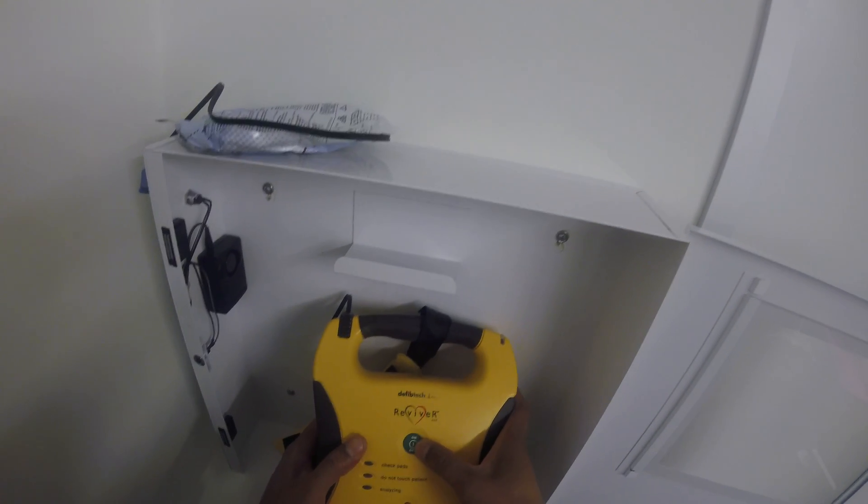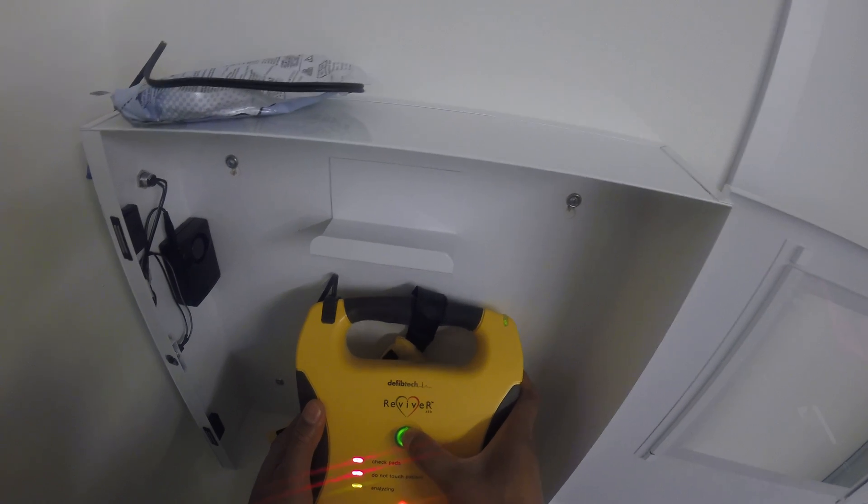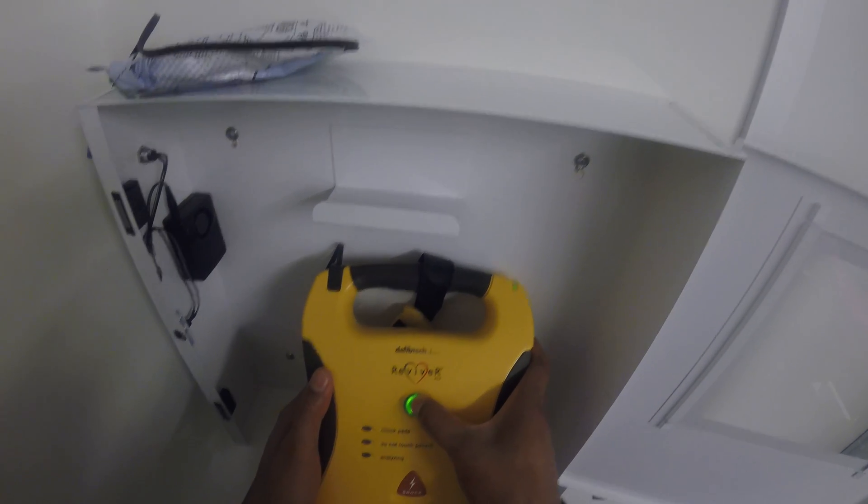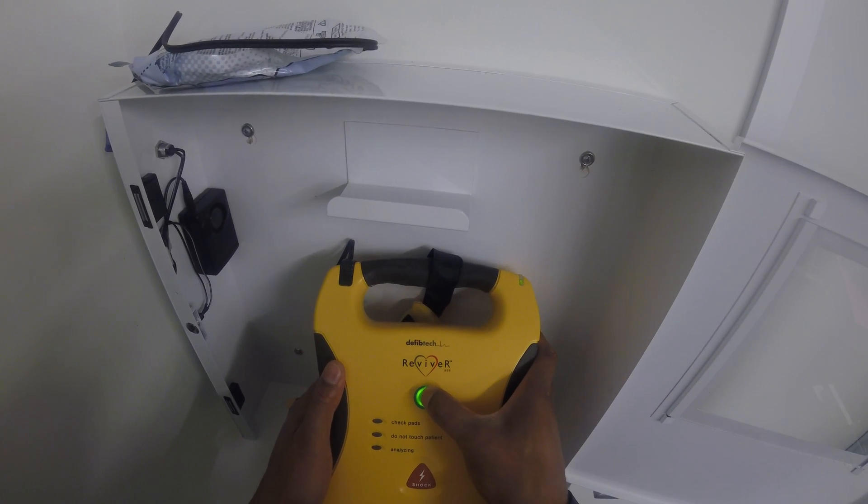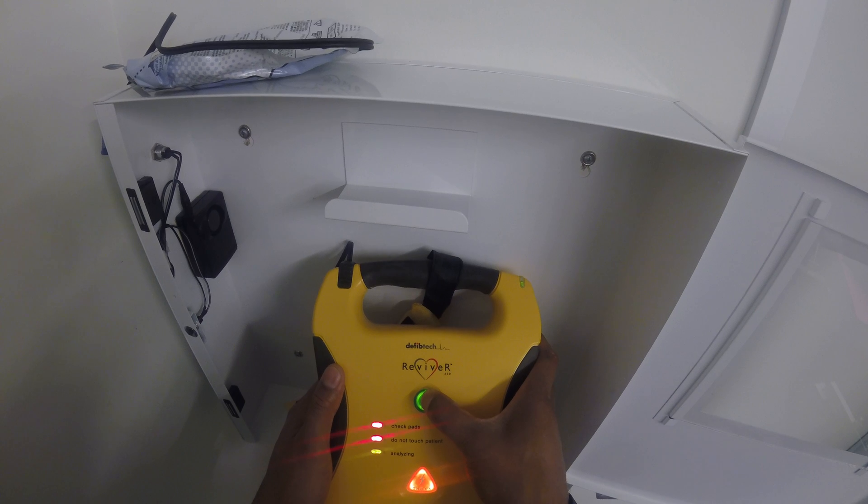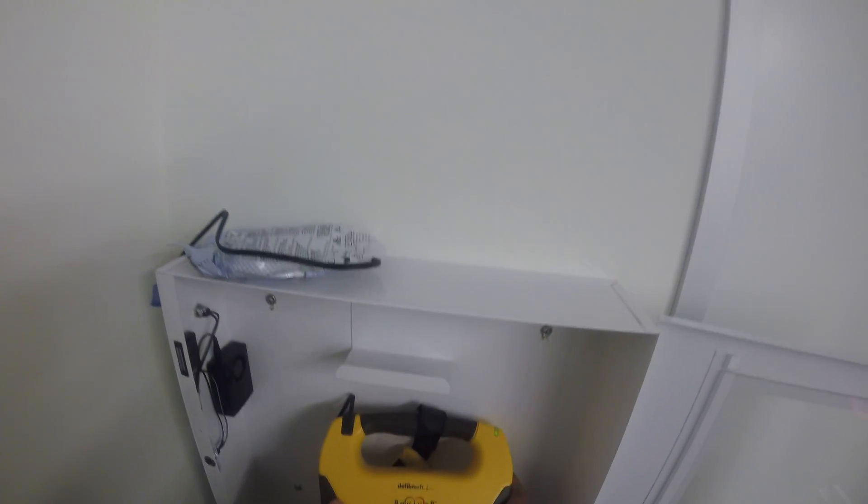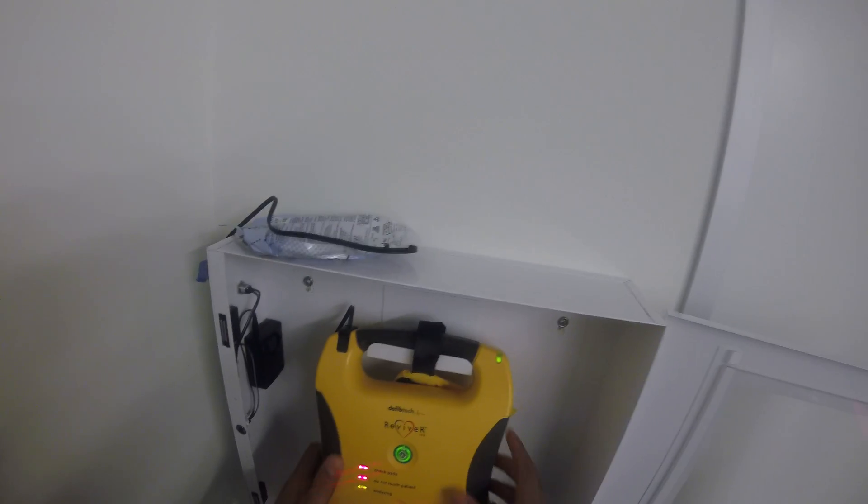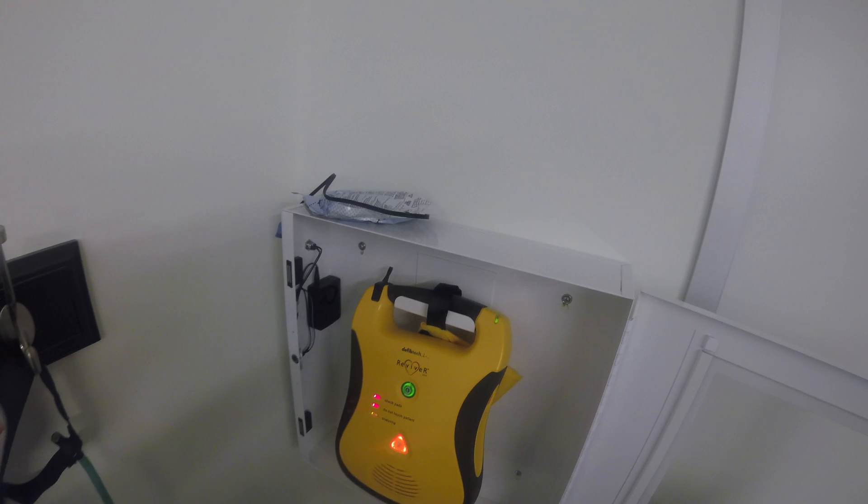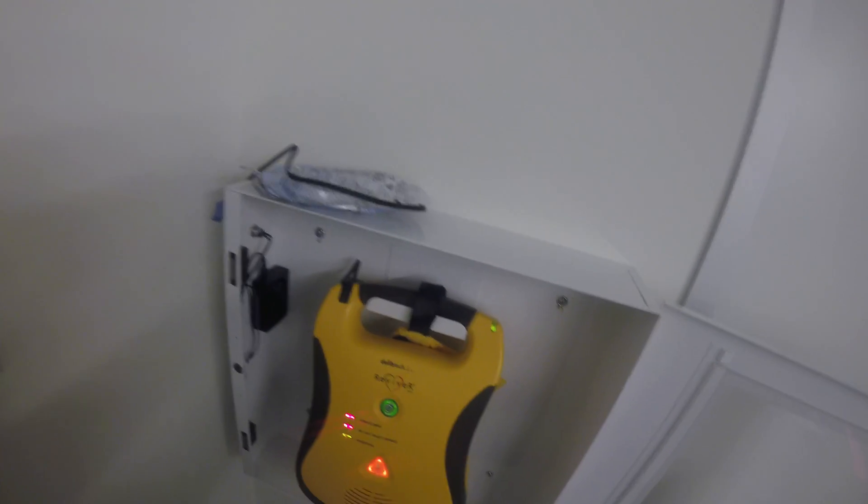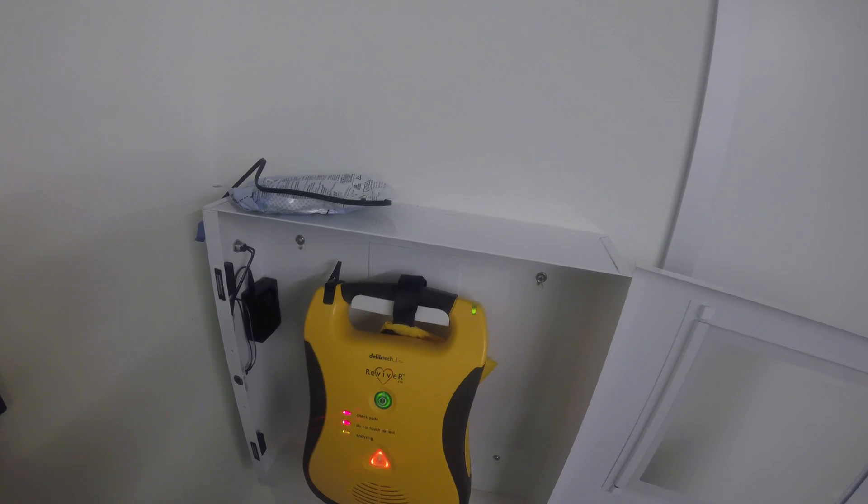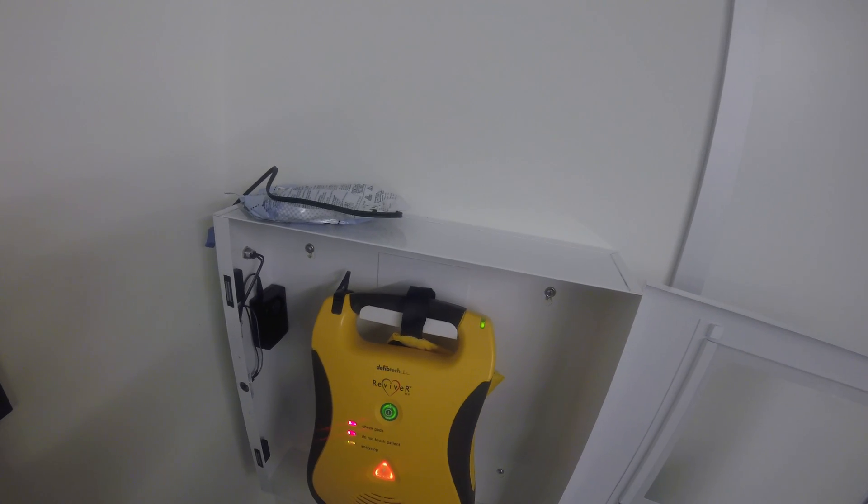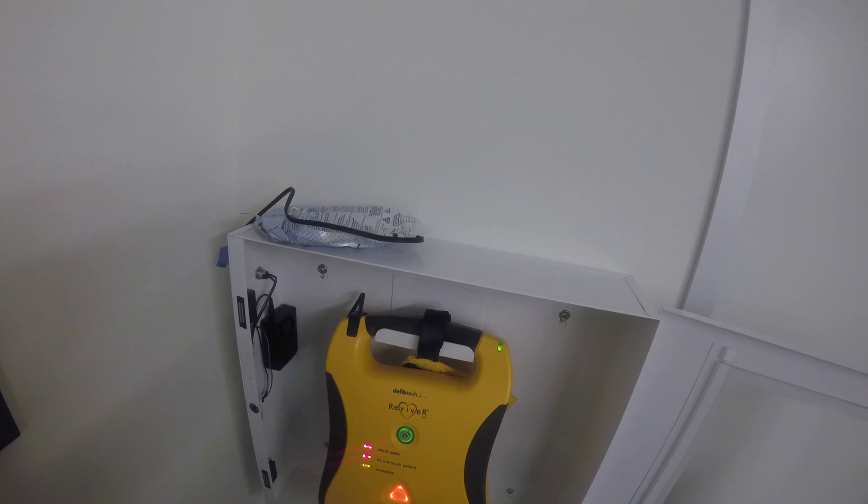Performing unit self-test. So when I hold it in like that, it's going to perform the self-unit test. It's going to take a couple of seconds and it's going to let me know if everything's okay with the Reviver defibrillator unit.